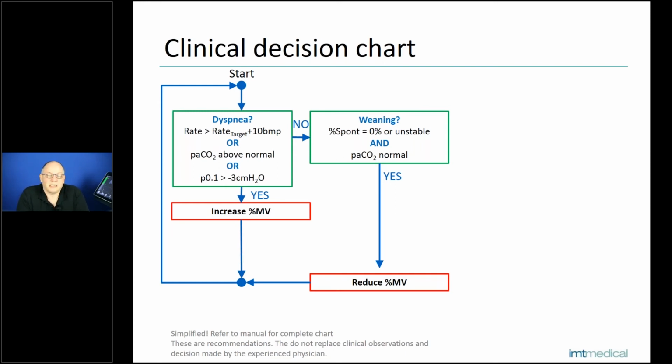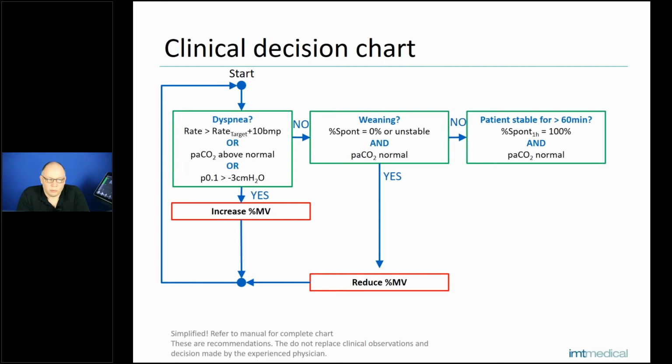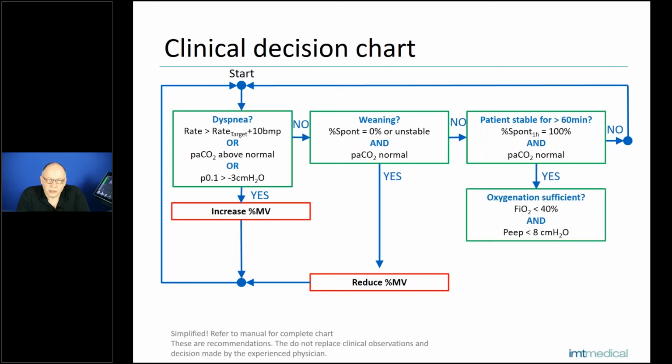Of course, this is just a chart. I can never imagine all the situations you will find in the clinical setting, and this doesn't replace the opinion or the decision of a clinician. This is not even a recommendation, it's maybe a strategy for how you can do the steps working with AVM, so this might be helpful. But of course, it can be totally different, and sometimes patients are doing differently than any chart in the world, but maybe it helps a bit.